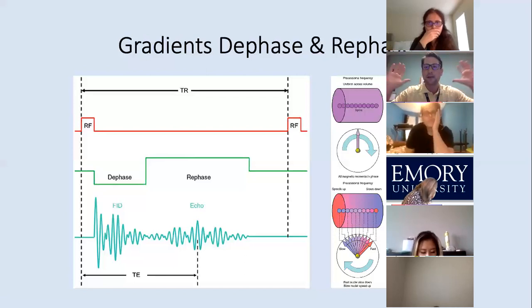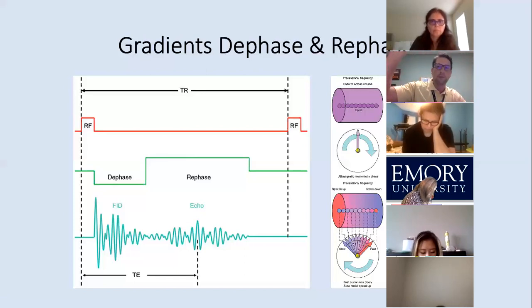When you have very big magnets, you have little pockets where you're going to get some variation in the magnetic field strength, where it could be higher at points and lower at others. That's what inhomogeneity means. You just don't have a very uniform magnetic field strength. And the 180-degree refocusing pulse compensates for that, but the gradients do not.